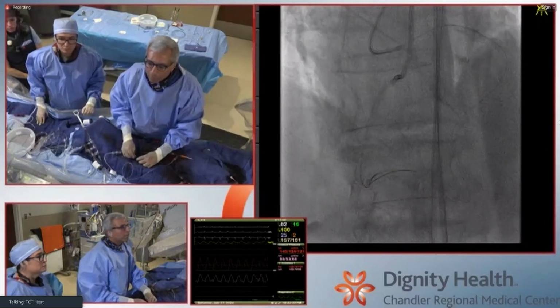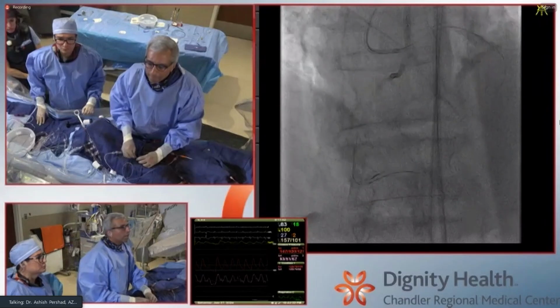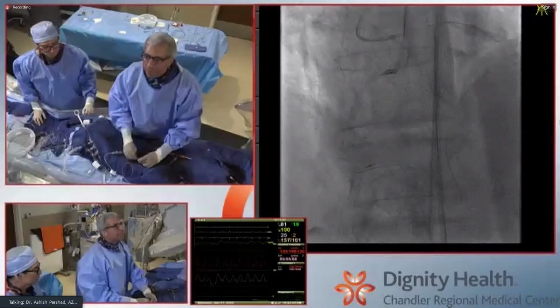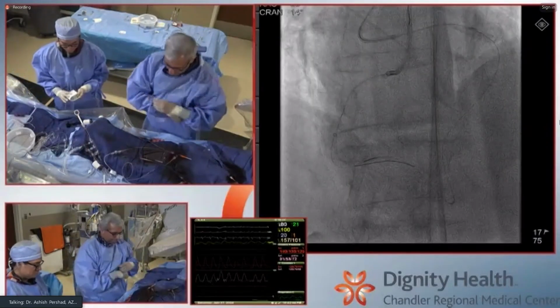No. This is that bit about trap liner down as far as you can to make your reverse CART life easier. Yeah. It's tough because you're coming around a bend. There you go. You got it now, right? Yeah. Nice job. Laura, save that. Yeah, that's it. Thanks, guys. That was great.